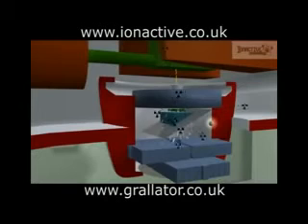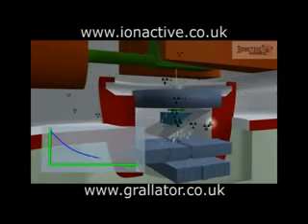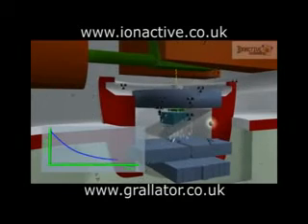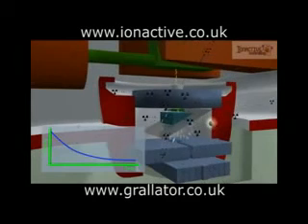The activated materials in the treatment head can deliver a dose to staff dismantling the head for setup and maintenance. The activated products are usually short-lived, so any radiation hazard during dismantling can be reduced by waiting for several hours after the last irradiation has finished. Because of the short half-life, it is unlikely that a significant build-up of activated material will occur.